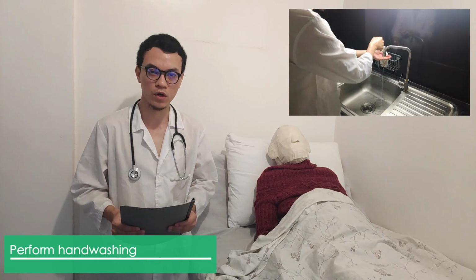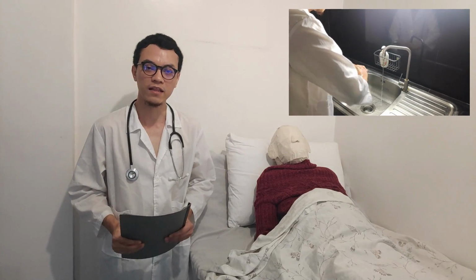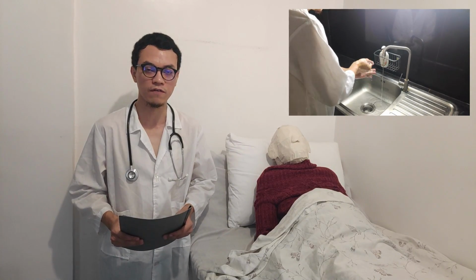Bringing all the materials needed will help us to perform our task efficiently and effectively because we don't have to go back and forth when we need something, which is time consuming. Next is perform hand washing and put on PPE if indicated. Hand washing deters transmission of microorganisms and bacteria.